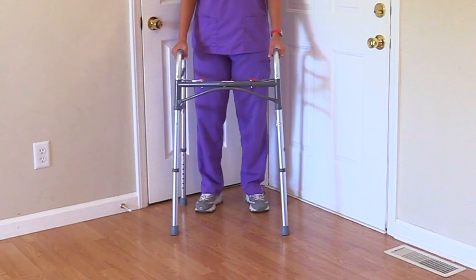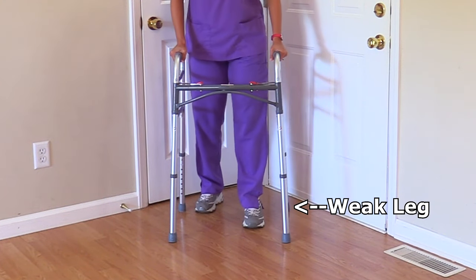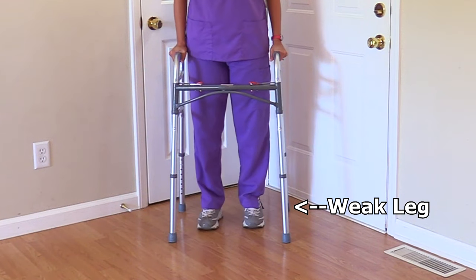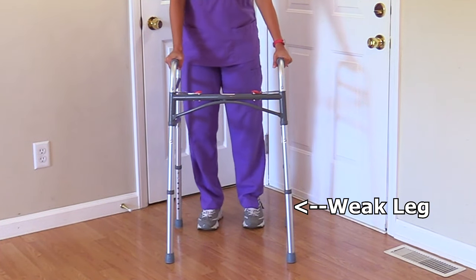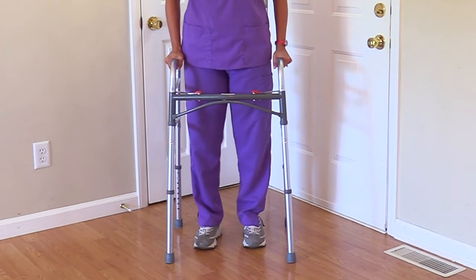To ambulate with the walker, the patient gets in position and holds on to the hand grips. First, they will lift and move the walker forward and make sure all four points of the walker are touching the ground. Then they move the weak side, put weight on the hands via the hand grips, and then move the strong side. They then repeat: lift the walker, move it forward, ensure all four points are on the ground, move the weak side, put weight on the hand grips, and move the strong side.